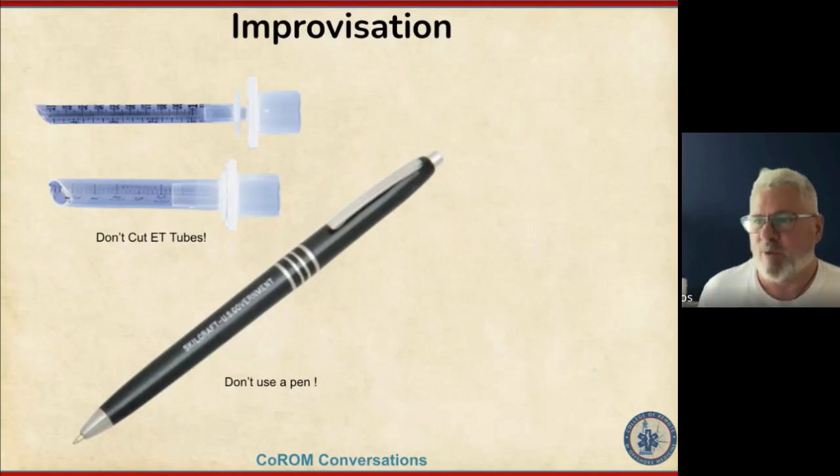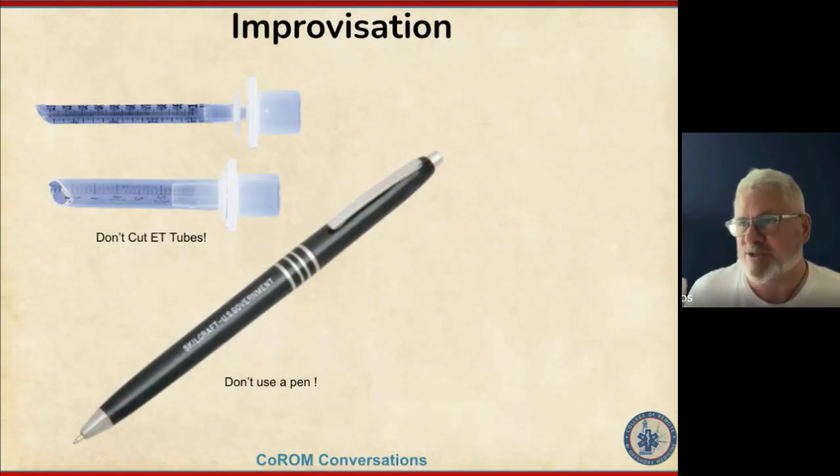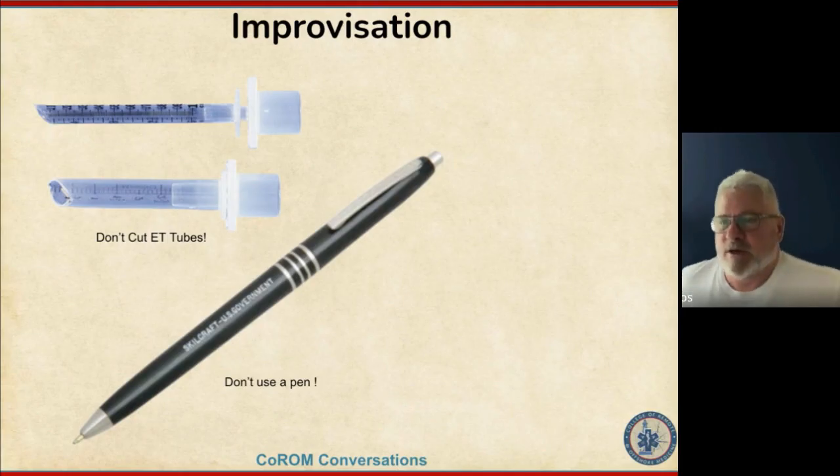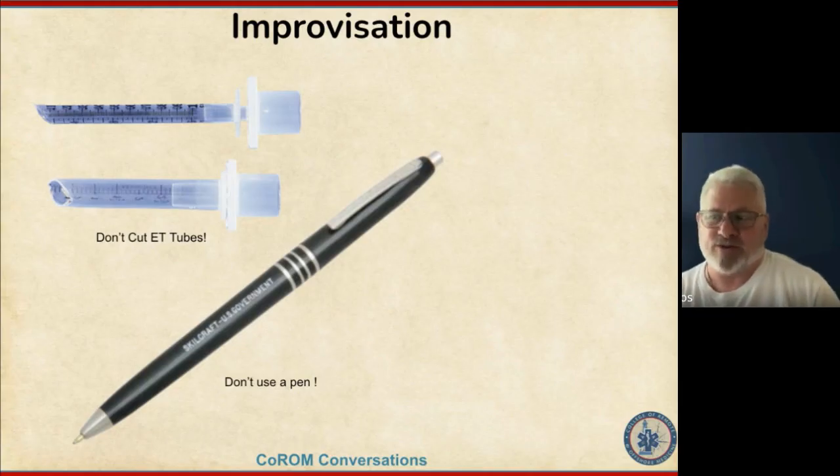One thing I point out too: don't cut the ET tubes. These are an accurate representation, but they're horrible, because if you're going to cut these tubes, you don't cut the end of the tube. You take the cap off the end and cut down the tube and leave the end of the regular tube intact, because those cut ends are too sharp. They're going to perforate the airway when you try to stick them in. They're not rounded, they're not blunt. Those are going to cause more complications. So if you do have to cut a tube, you cut it at the top and then put the cap back in.